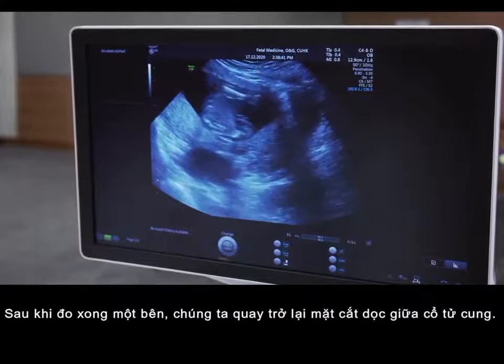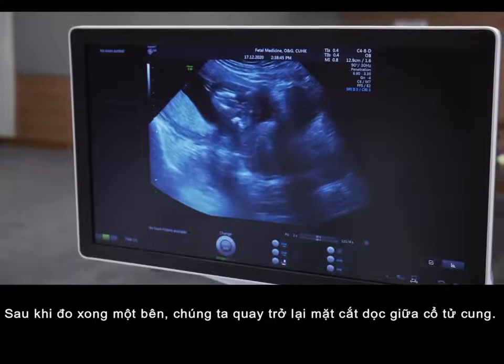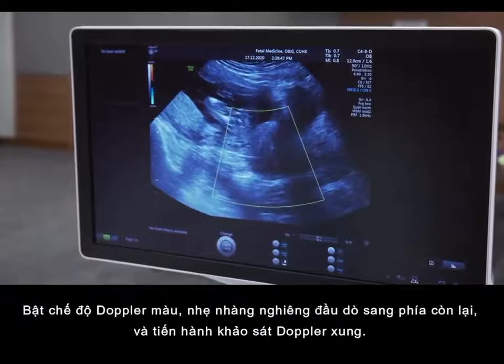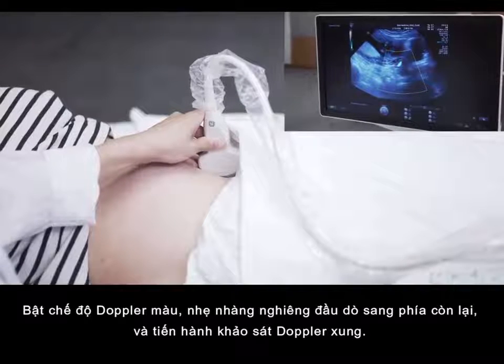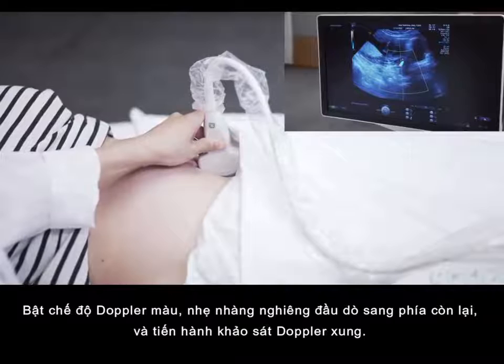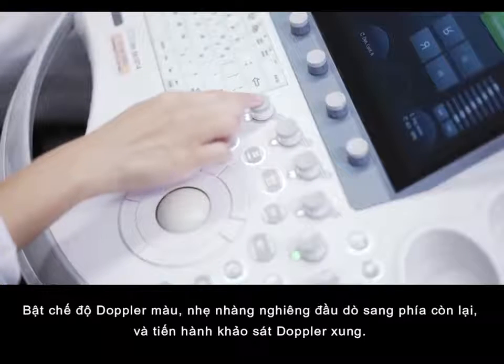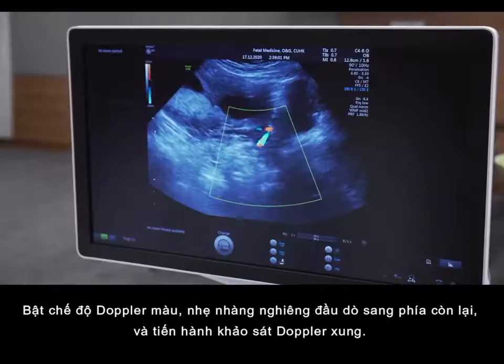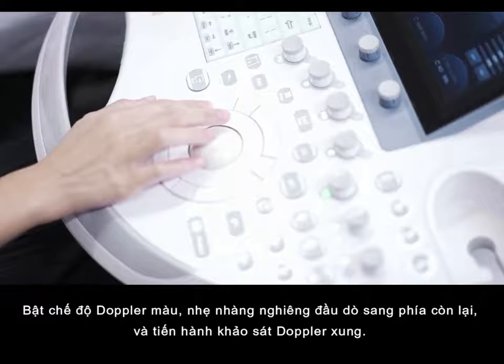Once you have measured one side, you can go back to the midline of the cervix, turn on color flow mapping, then you gently tilt the probe and again you can use pulse wave Doppler, pressing the left button.